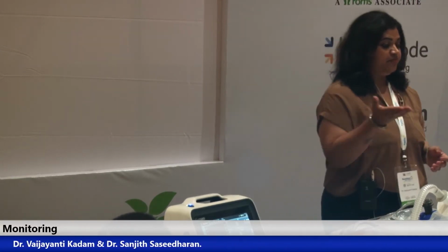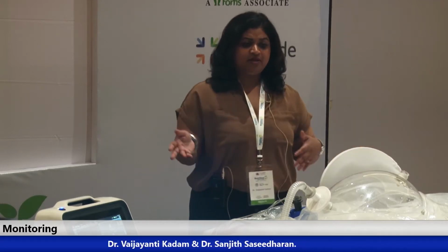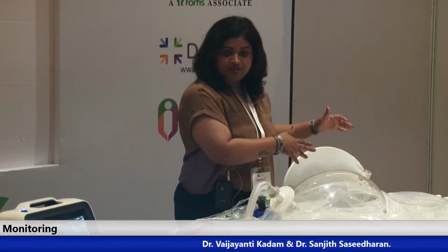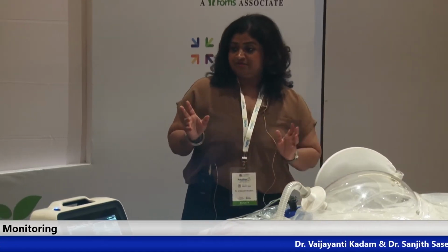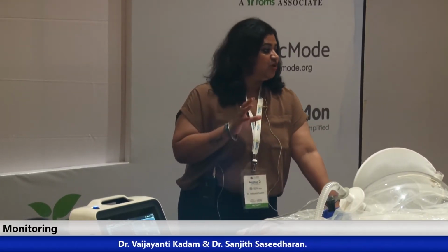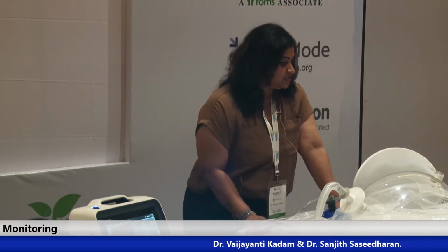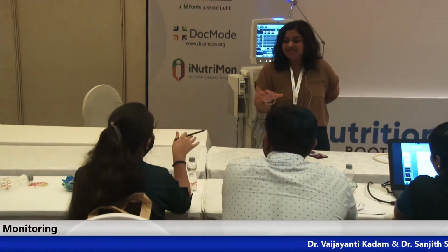Fortunately, we have these predictive equations, we have these weight based things, but what is the problem with these weight based and predictive equations? That there are n number of equations, isn't it? Which to follow, what to follow. This hospital must be following one predictive equation, the other hospital is following another. And we do not have any specific guidelines stating that the morbidity and the mortality reduces when you are using a particular equation, right? And the most important thing is, they are less than 40% accurate. The accuracy of these predictive equations is less than 40%. Isn't that just too much? And 40% means 60% of the times we are feeding our patients wrongly. That means we are probably not doing a great job by following these methods and feeding our patients. Okay. So I am not saying it, it is the studies which have said that it has got 40% accuracy.